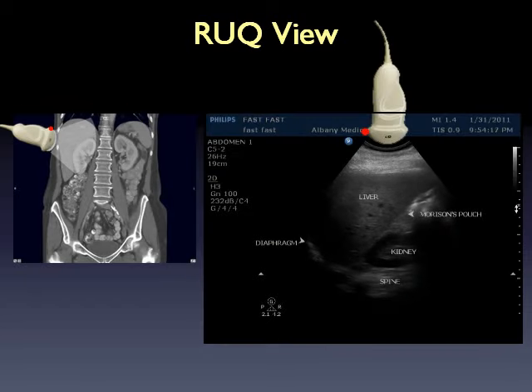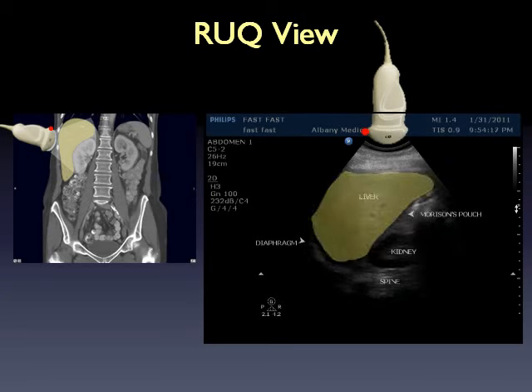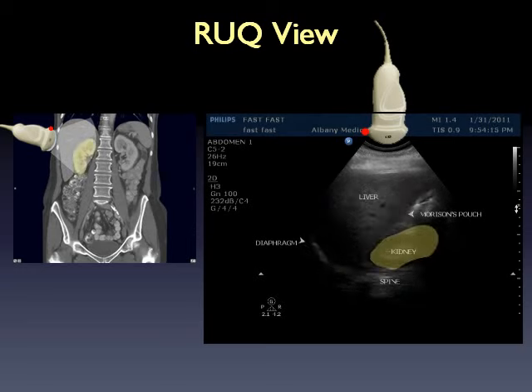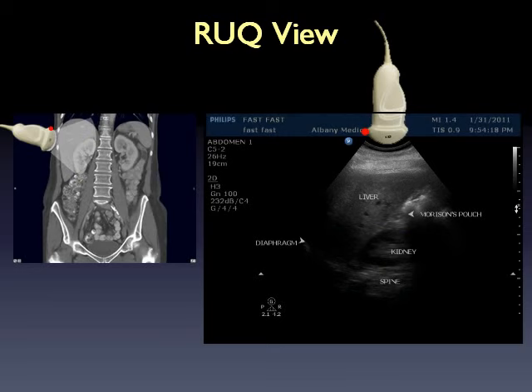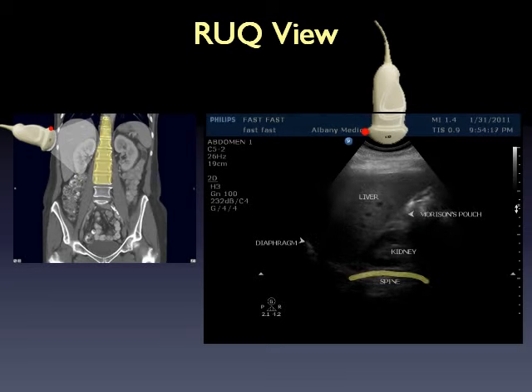Position the probe mid-axillary line below the costal margin, indicator towards the patient's head, probe face aimed back towards the spine. In this right upper quadrant position, you're obtaining a coronal view — the ultrasound beam slices through the patient from their right side toward their left to produce the image on the screen. You can place your probe along the mid-axillary line because the liver is a large imaging window. The liver appears at the top of the screen, closest to the probe; the kidney appears in the middle; and the spine at the bottom, furthest from the probe.